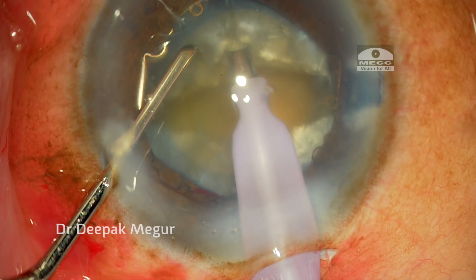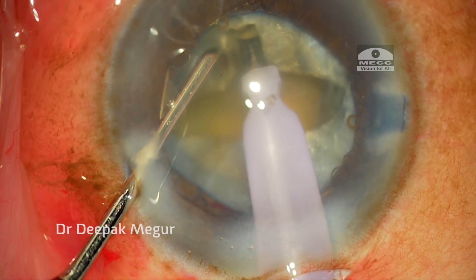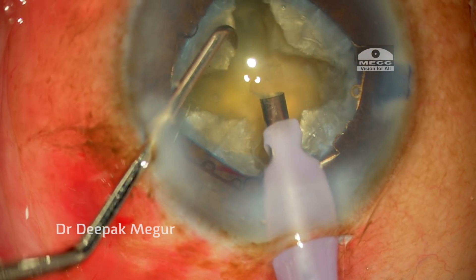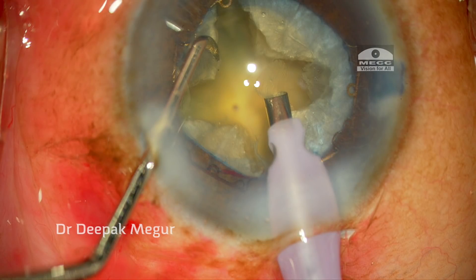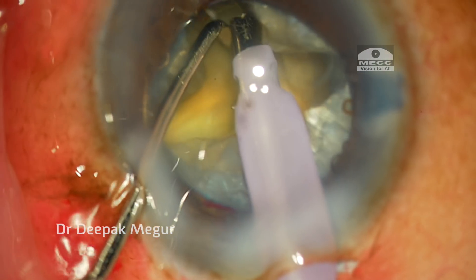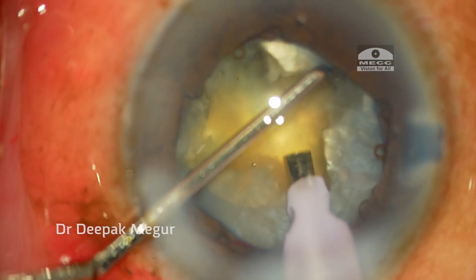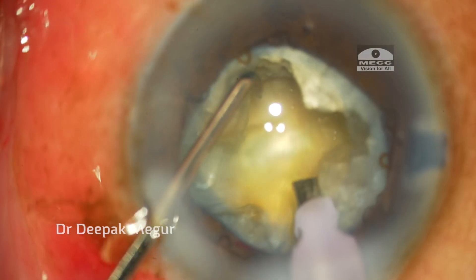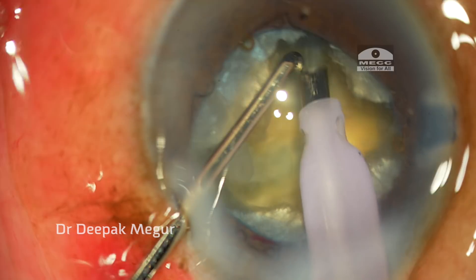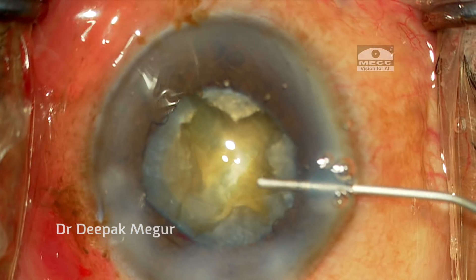I am able to create four grooves, and the depth is very critical because I want to separate them without any stress on the zonules. All the grooves are 90% deep. Using the phaco probe and my chopper, I gently separate each of these fragments — the separation cannot be achieved in a single go, so I use the two instruments at multiple levels to achieve lateral separation without causing zonular stress. I again repeat OVD injection to keep the bag stretched.